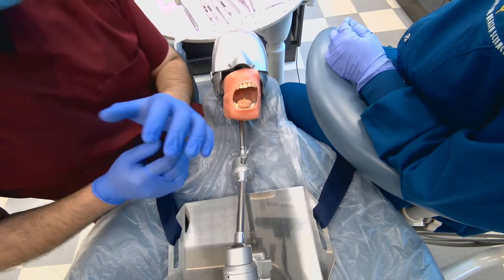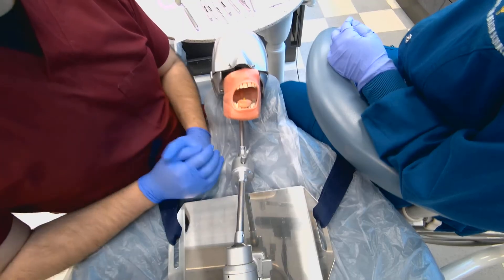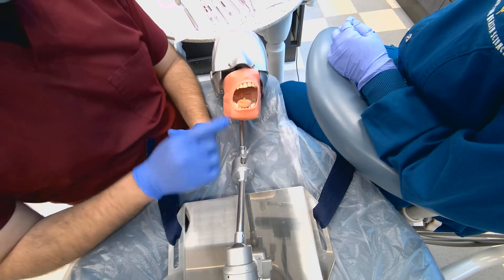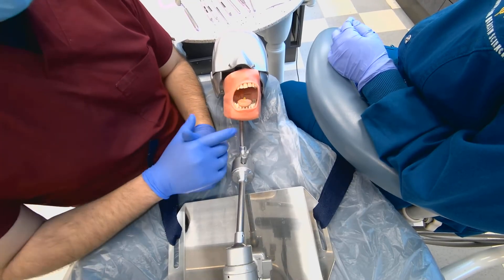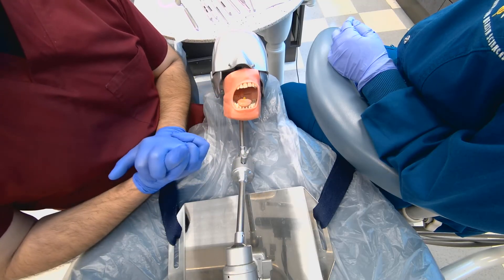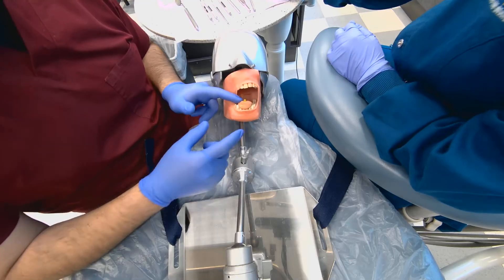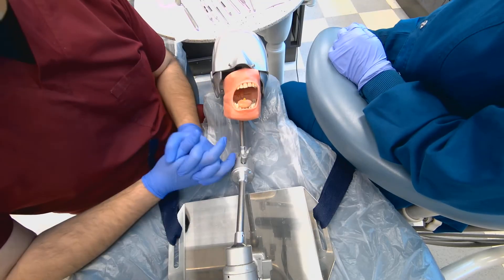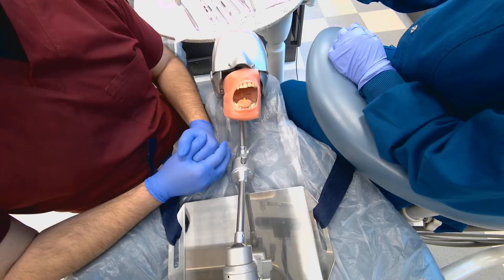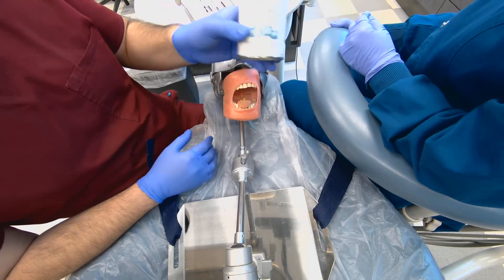We are going to demonstrate how to do a standard endodontic treatment for our fake tooth here, using the standard system. First of all, we have to take an x-ray for the tooth to see what's going on with it. And then we have to do a vitality test for the tooth using endo-ice, which you see here.